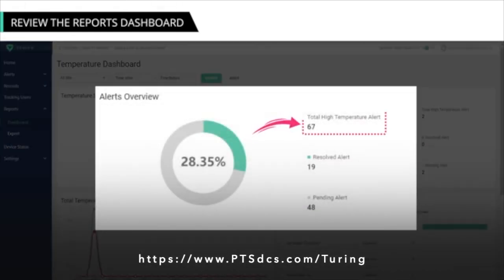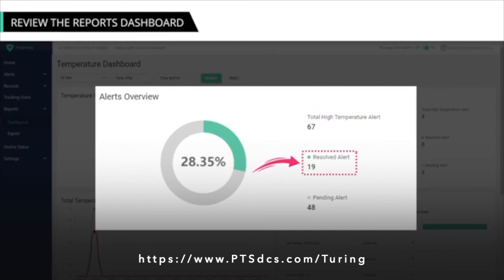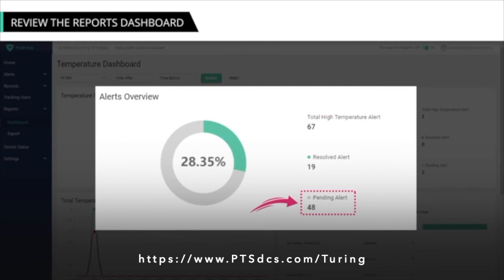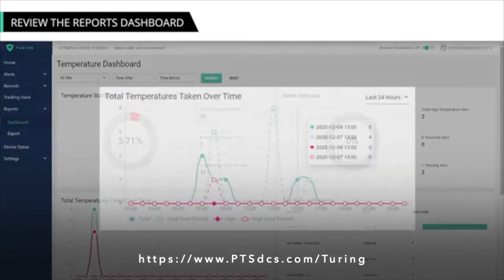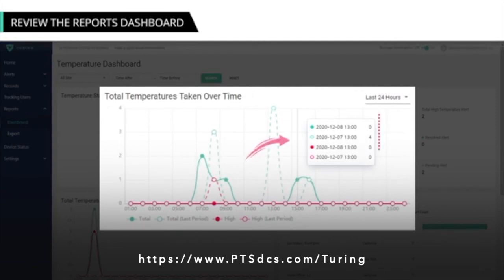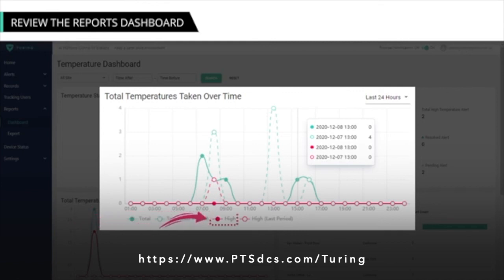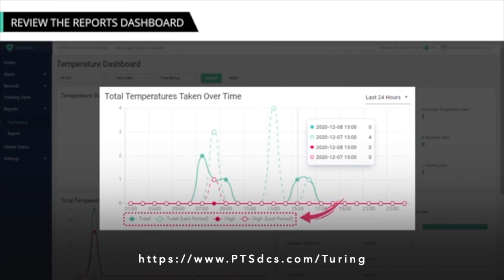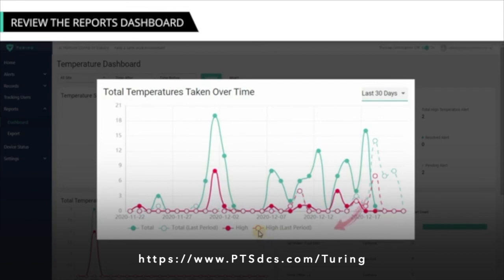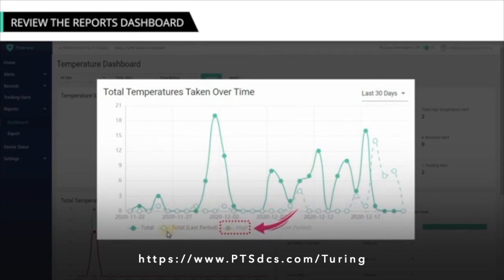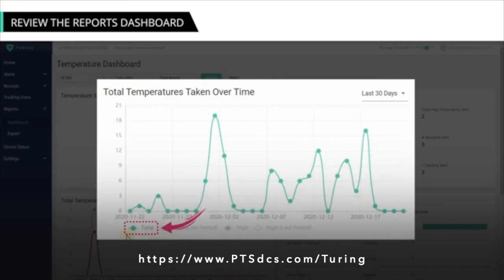The Alerts Overview graph shows the total number of high temperature alerts received at a site or all your sites, which have been resolved, and which are pending — so you can initiate action on the pending alerts. The Total Temperatures Taken Over Time graph shows all temperatures taken over a certain period, similar to the Alert Trends graph on the Home Dashboard. At the bottom of the graph, you can click options including Total Current Period Temperatures, Total Last Period Temperatures, Total High Temperatures for the Current Period, and Total High Temperatures for the Last Period. For example, if you deselect Last Period High Temperatures, Current High Temperatures, Total, and Last Period, the graph will display the total temperatures taken for the current period only.